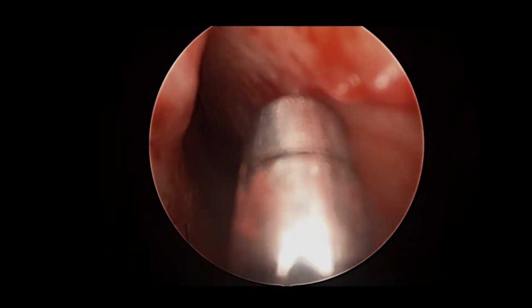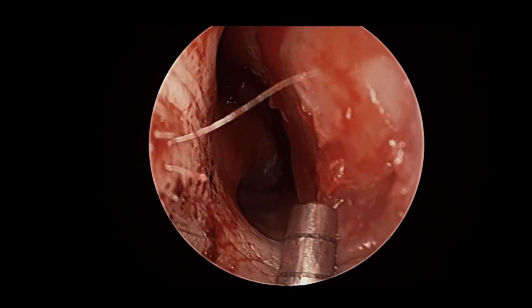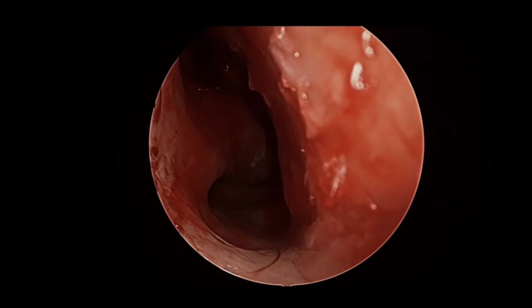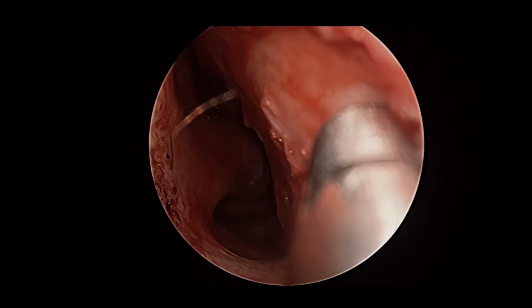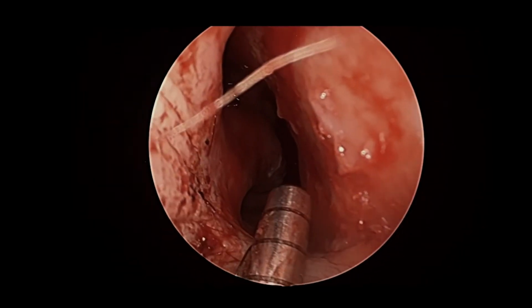After completing the scraping, we can see that up front there's a very pale area where actually the perichondrium has been unfortunately scraped away. But for the most part, we have a good bed of perichondrium that will allow the mucosa to grow over this area most rapidly.